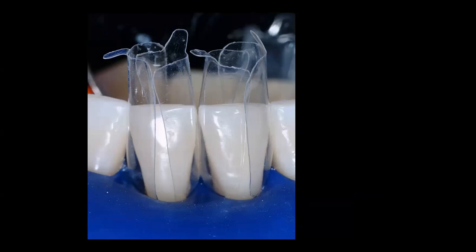I looked under my microscope. I do all my dentistry with the microscope. I looked under the microscope and I said, wow, look at that. These margins are going to be amazing, and I'm not going to have a black triangle, and I know it's going to be healthy. I need to come up with a method. I need to figure out how to get the composite in there to this infinity edge. And that was the day that the Bioclear method started. That was a long time ago.